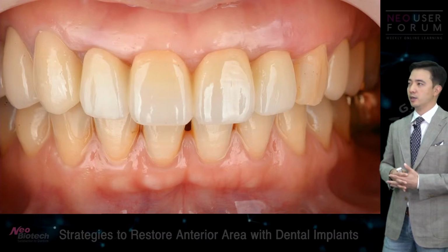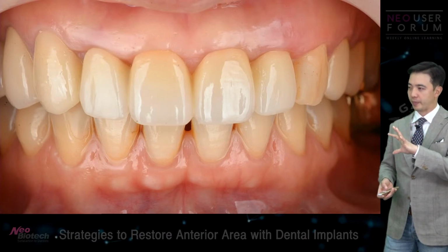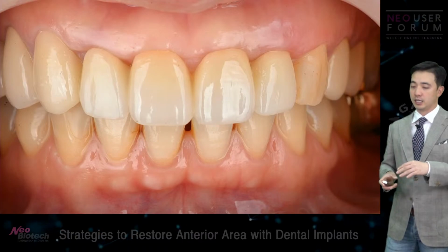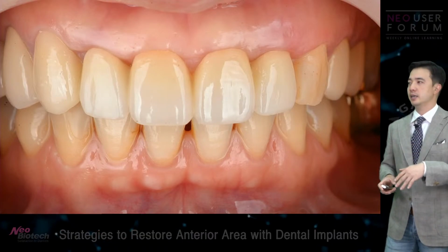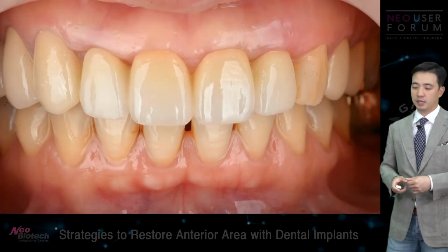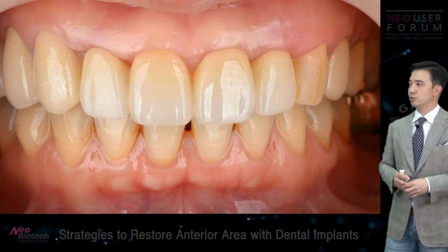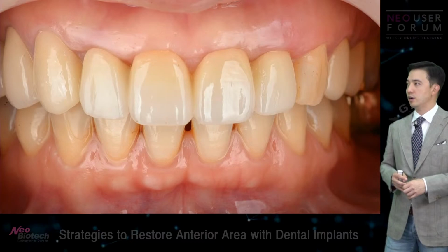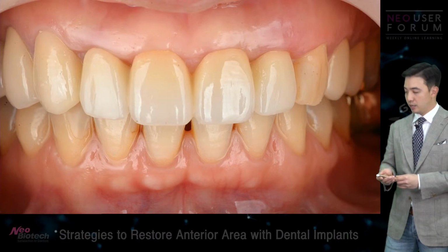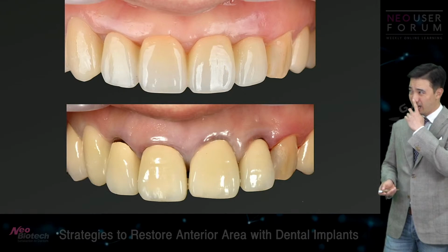resorption. I didn't really describe it for this case, but what I did was kind of an envelope flap, so through and through the sulcus. But yeah, I think that's enough to treat these kinds of cases rather than opening a whole flap, okay? And the patient was happy because she never really went through a big pain.